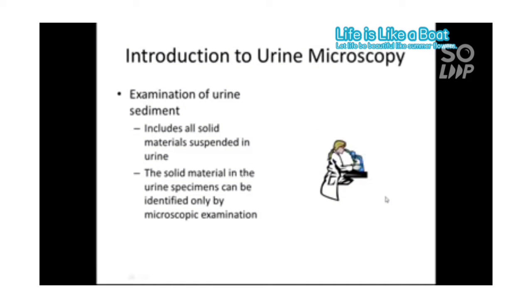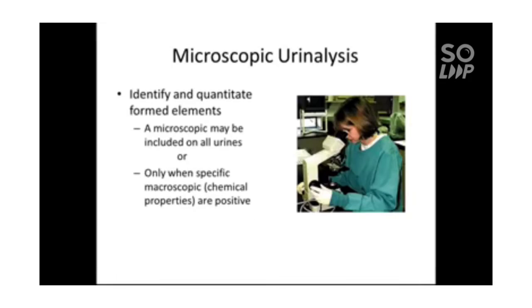Microscopic Urinalysis lecture. Introduction to urine microscopy, which is the examination of the urine sediment. It includes all solid materials that are normally suspended in urine. The solid material in urine specimens can be identified only by microscopic examination.